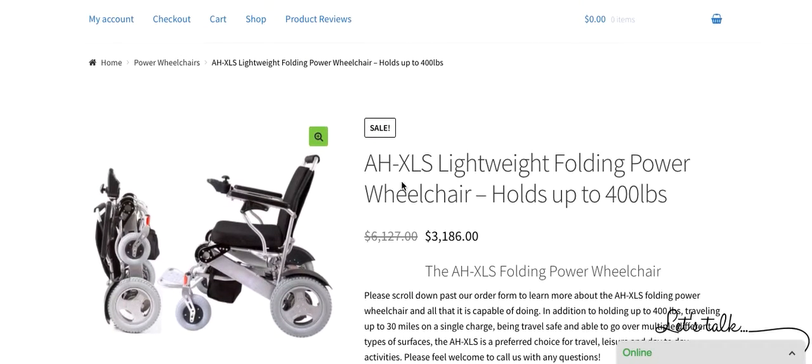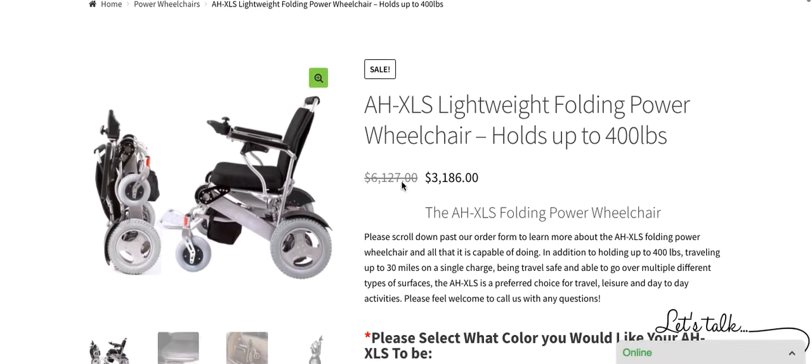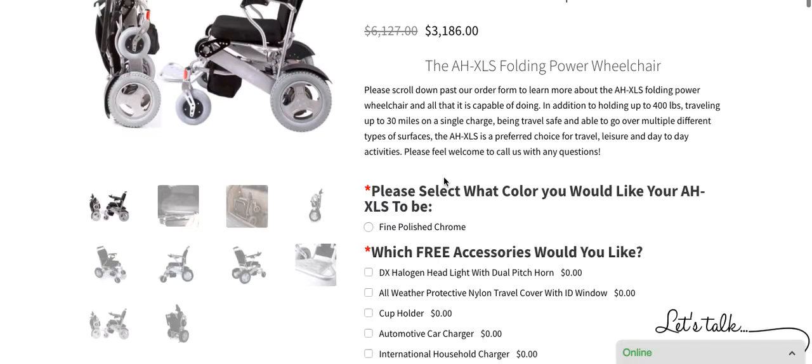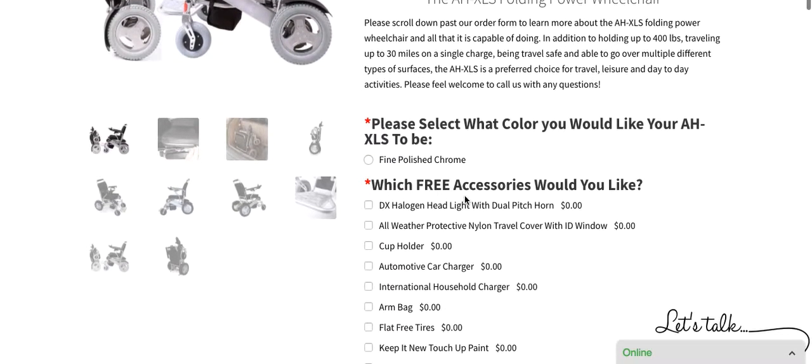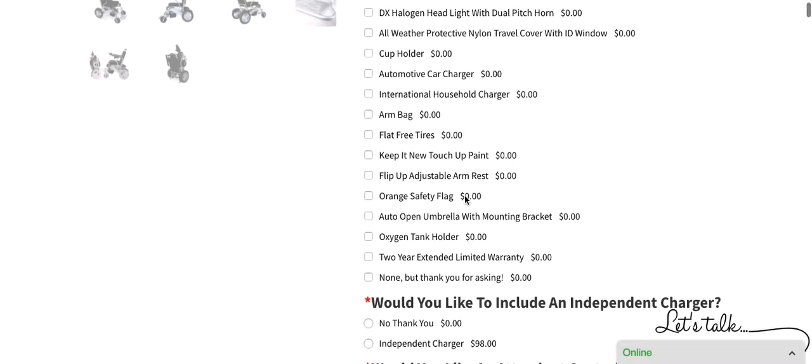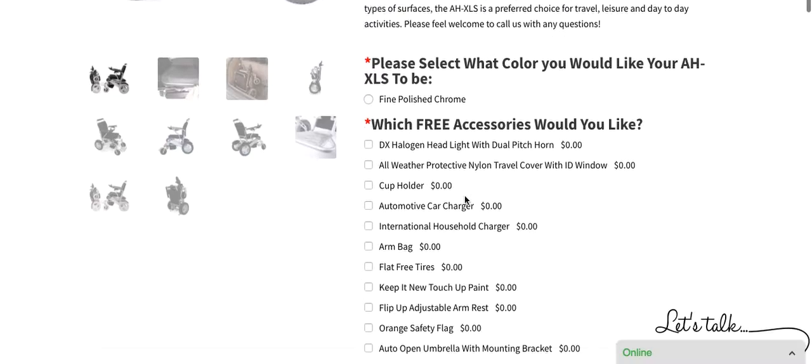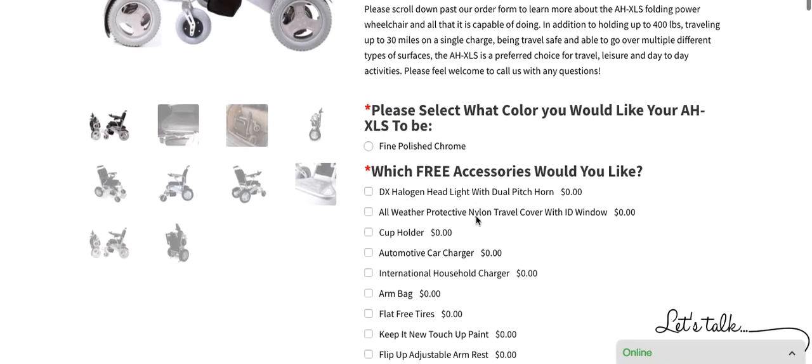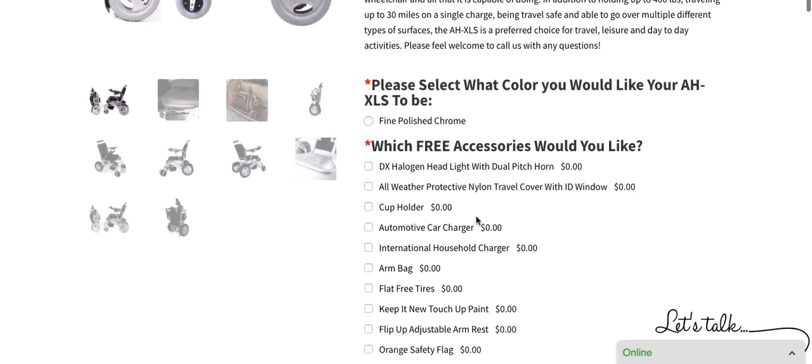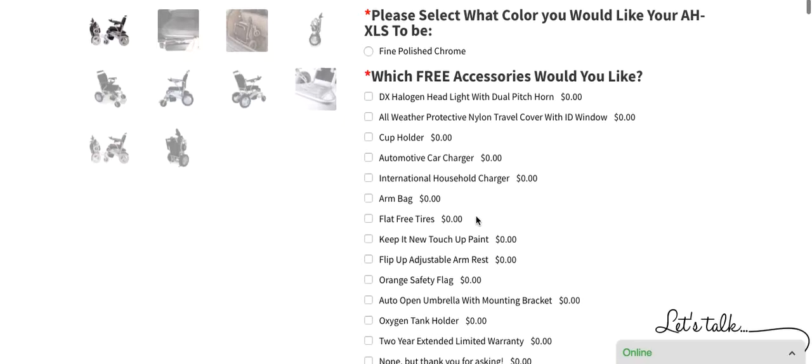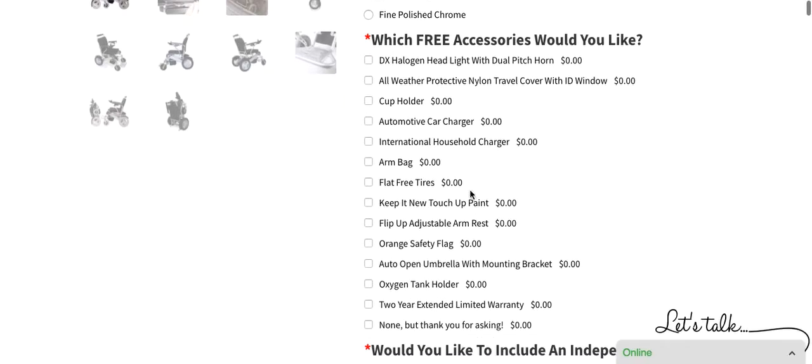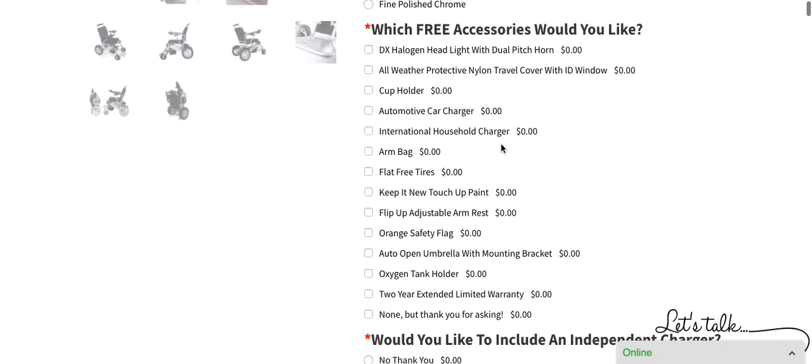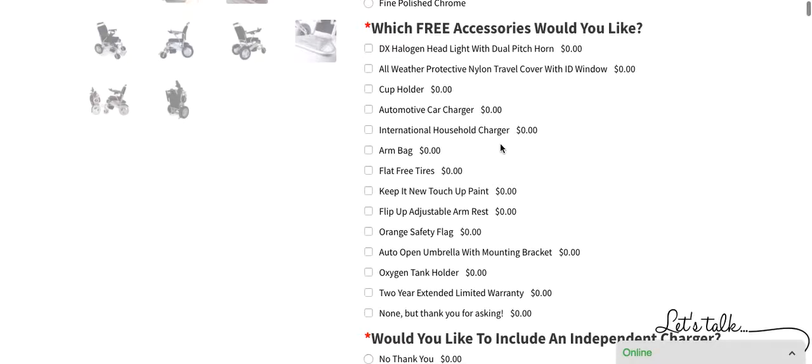If you're looking at our website on the computer or on a phone, you will notice the order form first. So, I will address the order form. With every AHXLS, you will also receive the DX halogen headlight with dual pitch horn, an all-weather protective nylon travel cover with an ID window, a cup holder, an automotive car charger, an international household charger, and an arm bag.